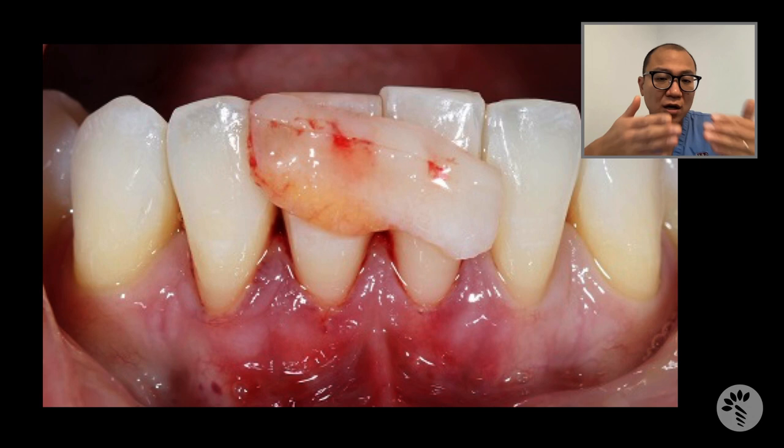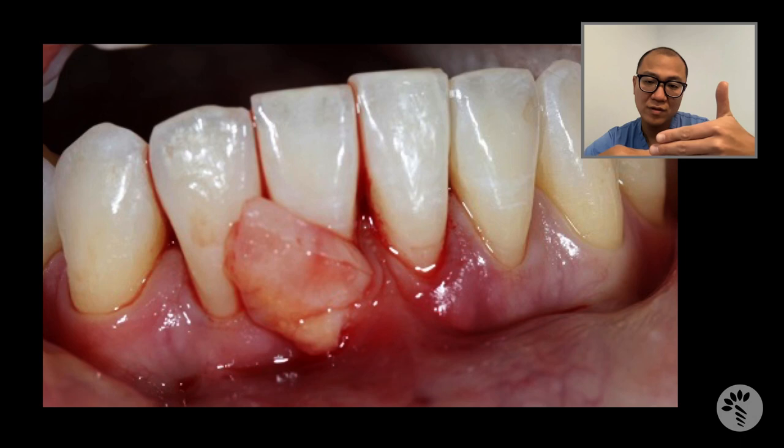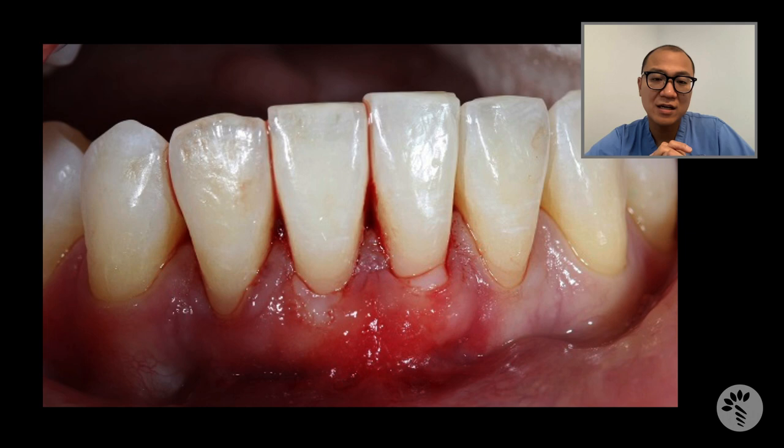Now, instead of cutting the gum open, I am going to introduce this connective tissue graft with epithelium into the tunnel. You can see I am inserting the graft from the right central incisor sulcus that I tunneled, sliding it through and positioning it within the tunnel.